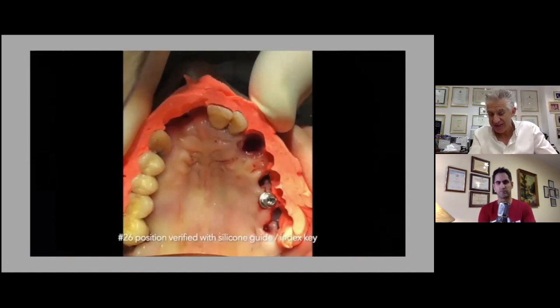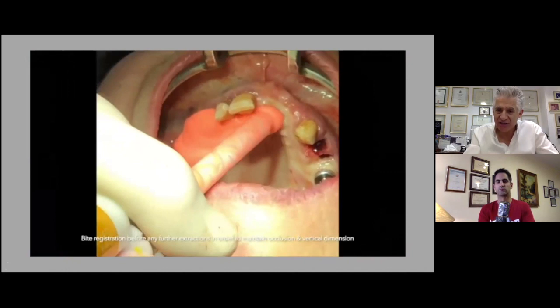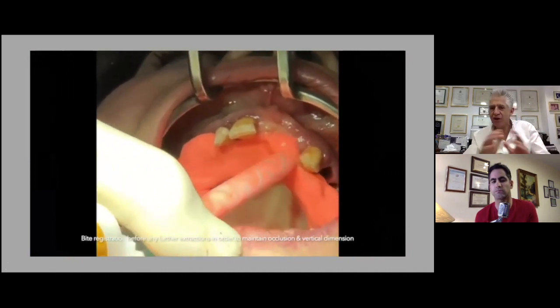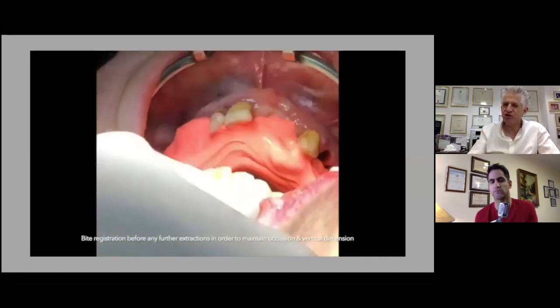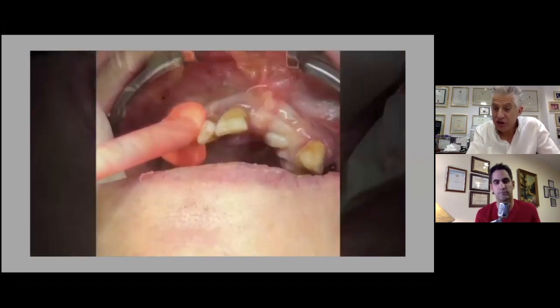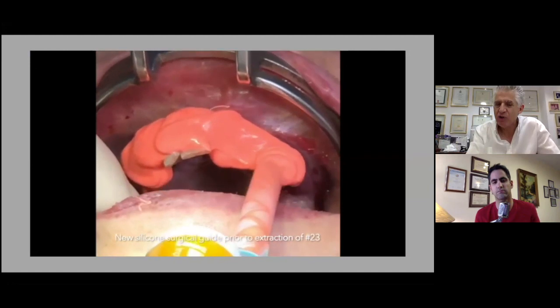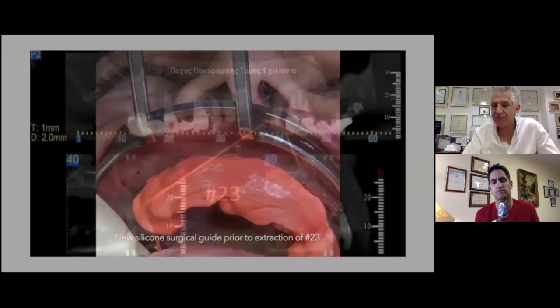This is a surgical guide that we make with bite registration material. The same bite registration material that we use to take the bite before we extract the final teeth. So we don't start off by extracting all the teeth. In my opinion, it's wrong to extract all the teeth because you lose vertical dimension, centric relation, you lose valuable information. You also, before you extract these teeth, make another guide, which will now sit or index onto your healing caps so that I can see exactly where, say for example, position number 23 is going to be.